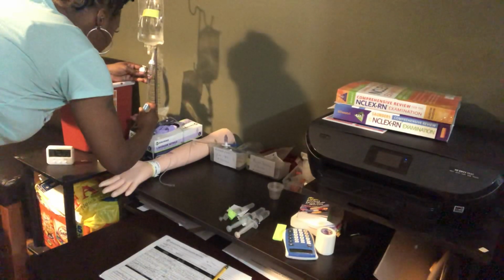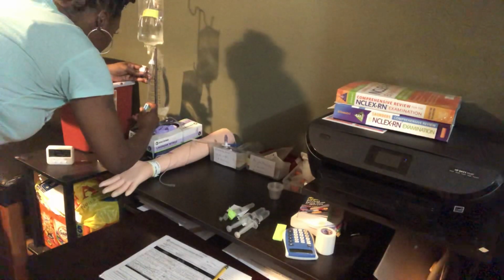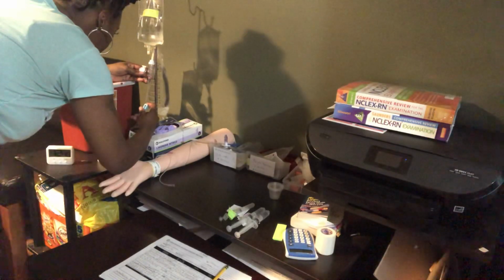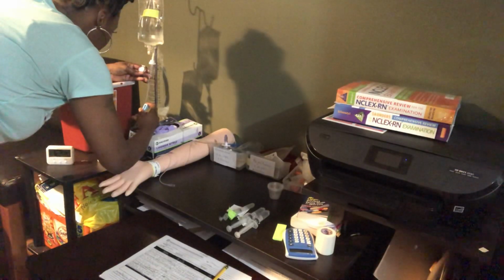And I'm just opening it up to the lowest point until I get some drops. Okay, let's see what we got here.